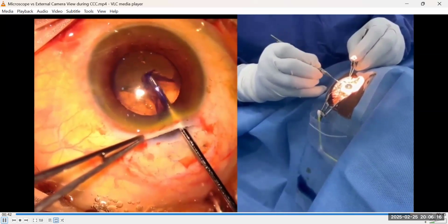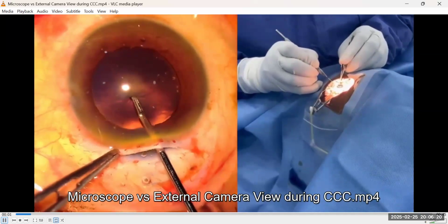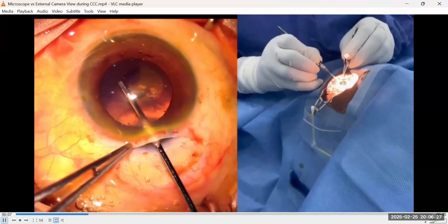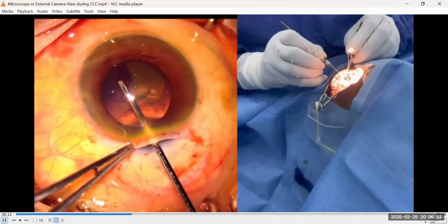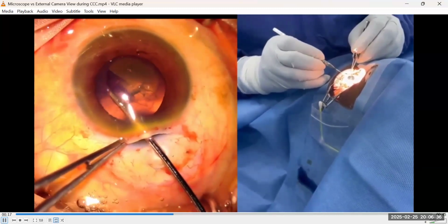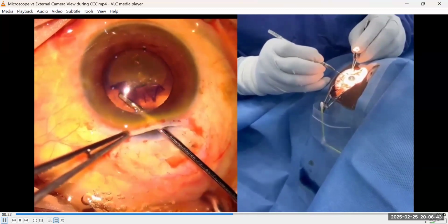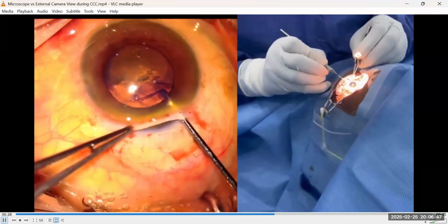Each time you want to make a motion, it is at the fingers, not even at the wrist. And truly, looking closely, it's a combination of a forward thrust and a backward retraction in that seamless motion that will give you both circumferential tear and centripetal pull.